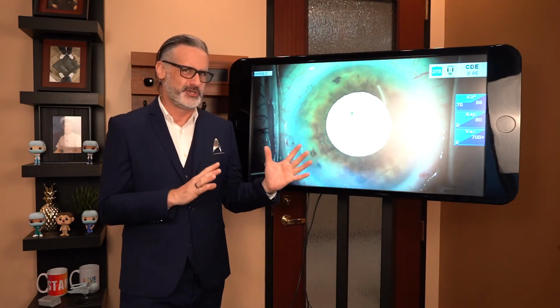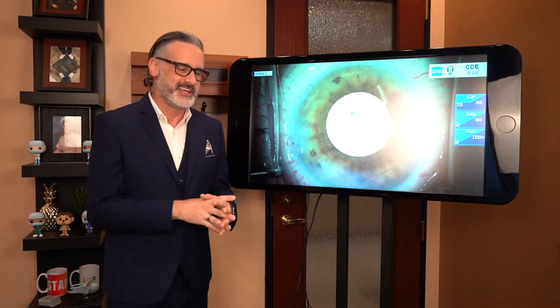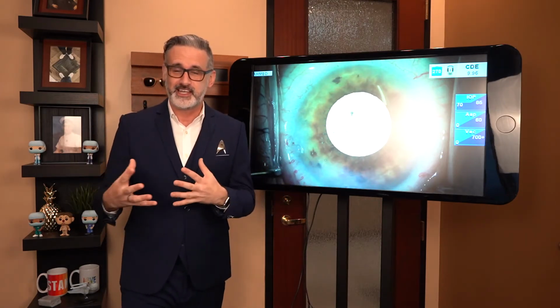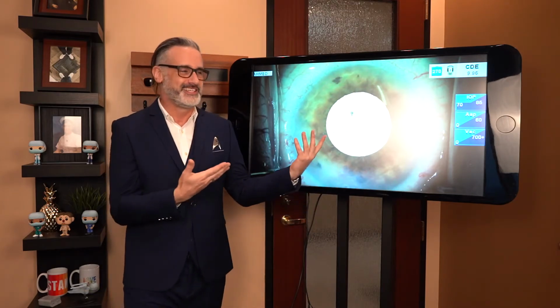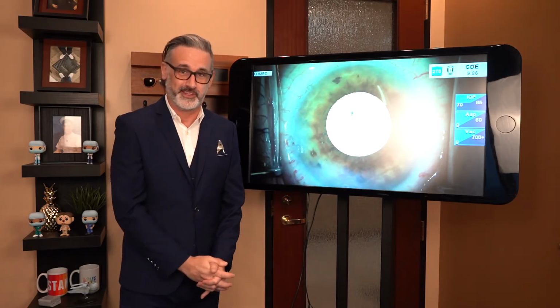And I hope it wasn't too gruesome for you, because oftentimes we do animated type of clinical videos, but go big or go home. So that's why I basically decided to do an actual live video for that.